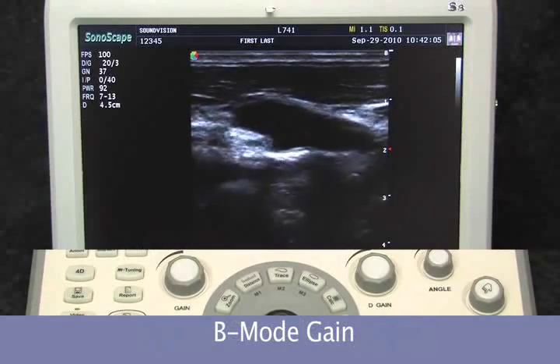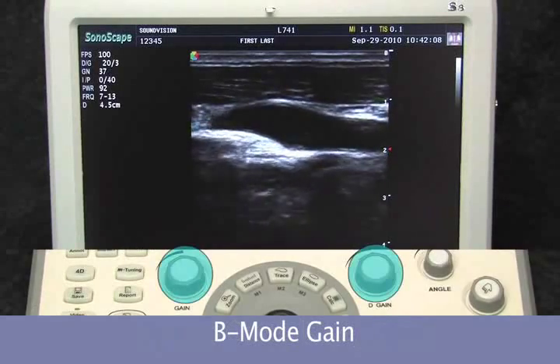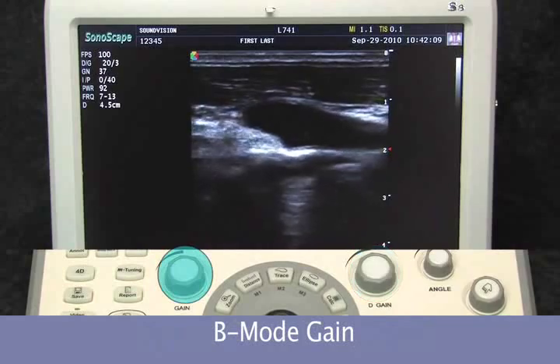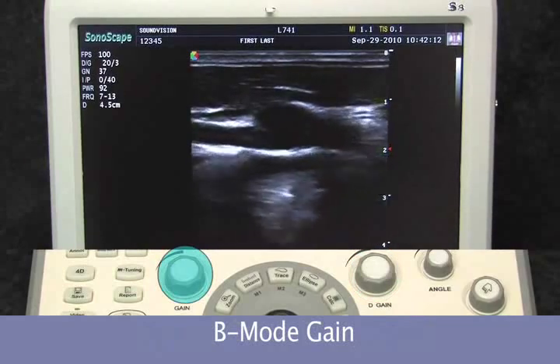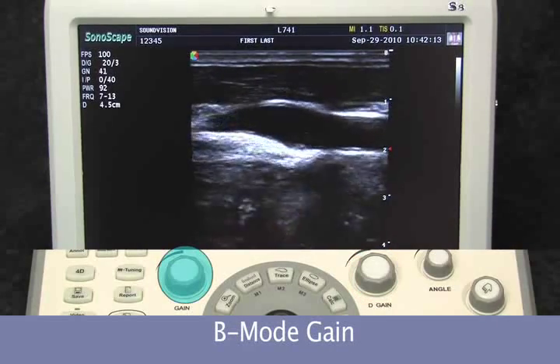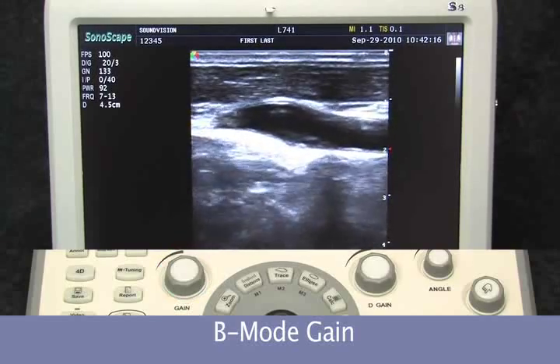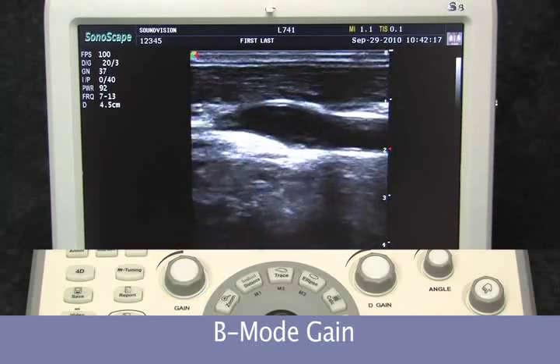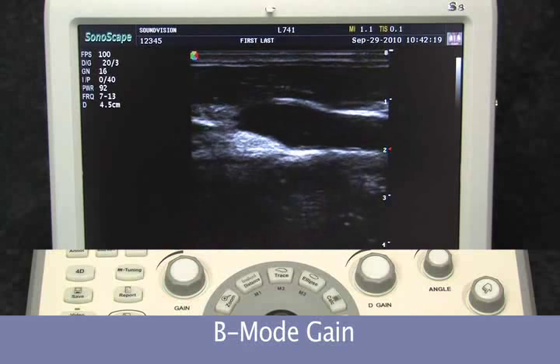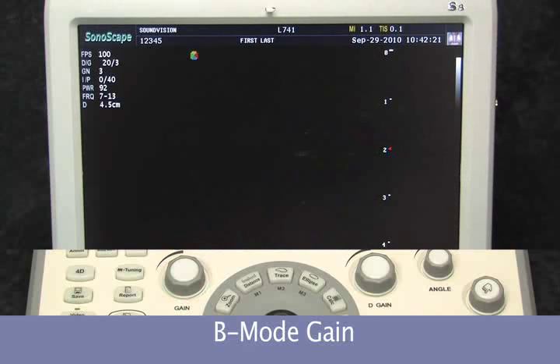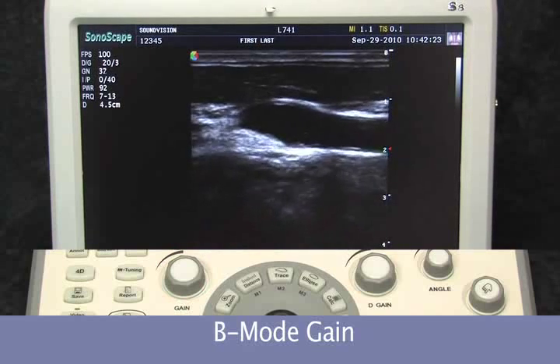The system gives separate keys for both B-mode gain and Doppler gain. General overall gain is on the left side of the screen. The large knob allows for increasing our gain — adjusting until finding an appropriate balance.